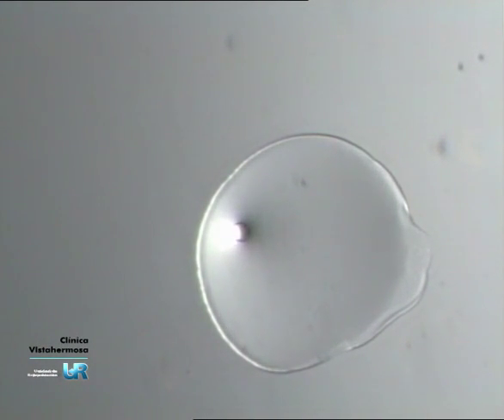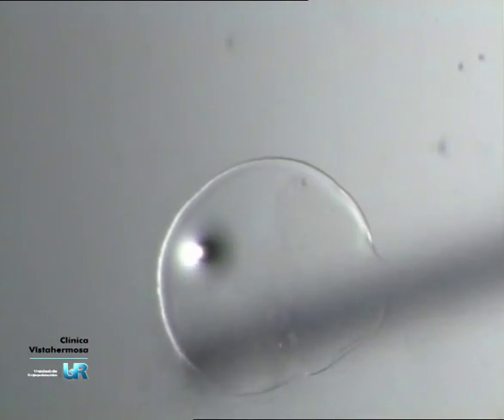Before the drop evaporates completely, let fall vertically on the sample a drop of Carnoy.